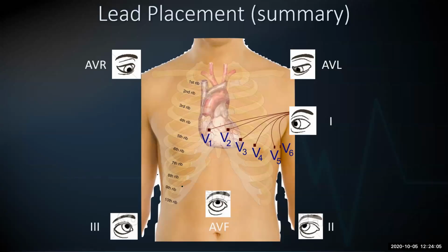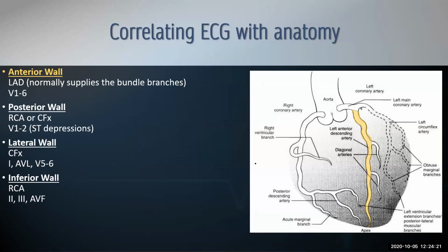So this is a slide that I told you I'd come back to, so you can see what the lead is basically seeing. This is what this slide represents. If you were to focus just on aVL and it's trying to read this electrical activity, what is it seeing on its own? It's seeing the activity going isoelectric towards it, or perpendicular.